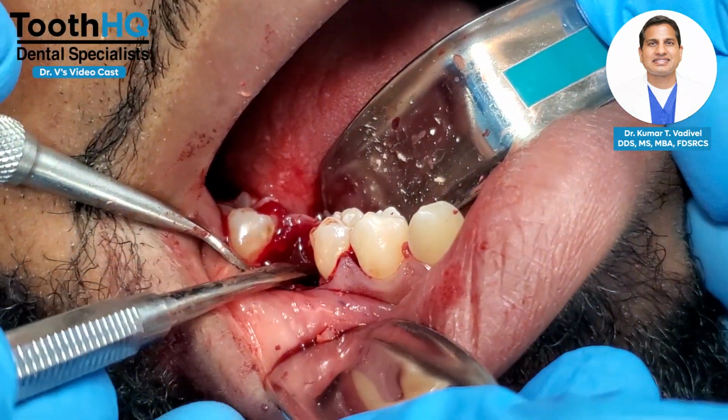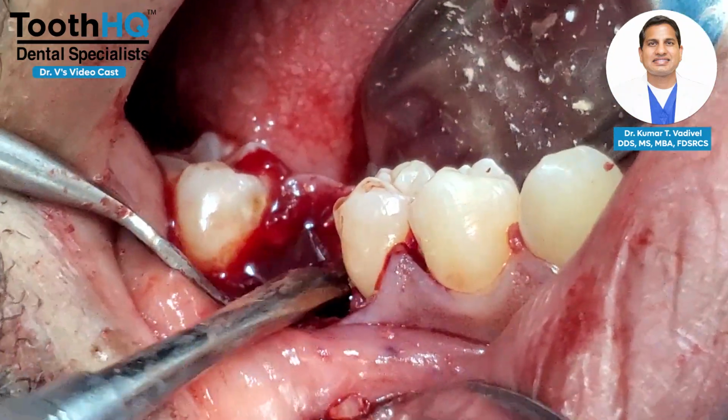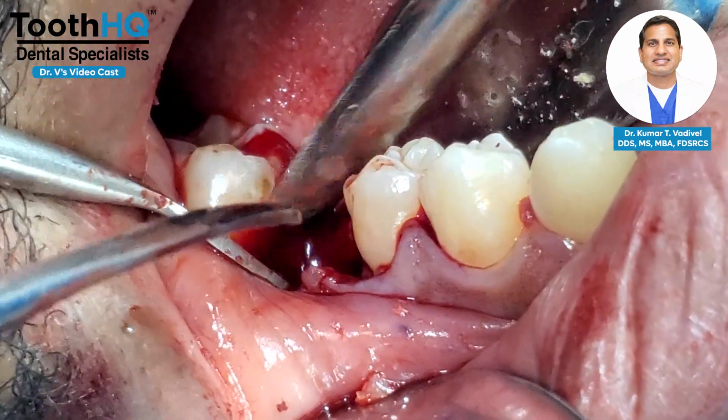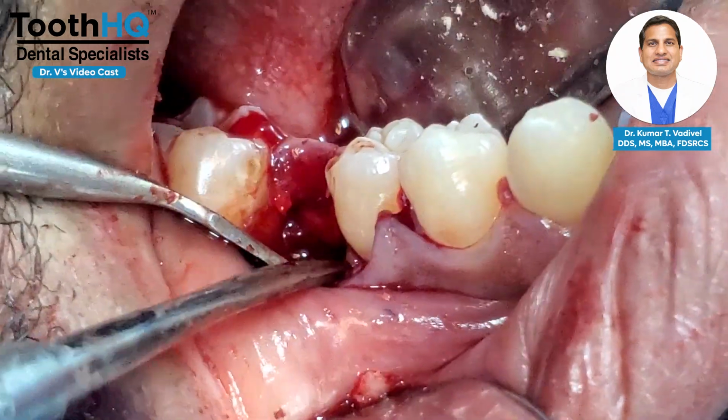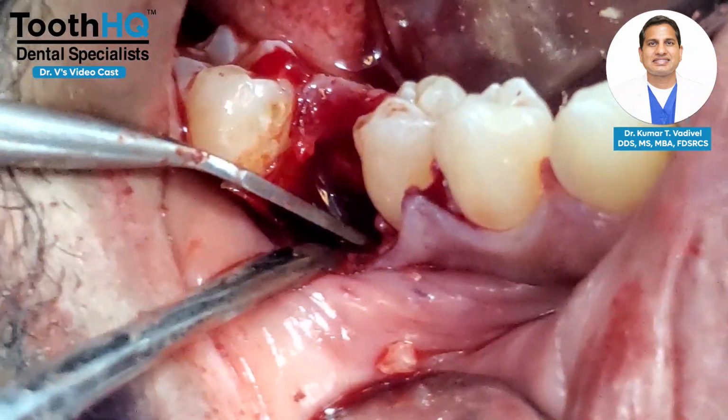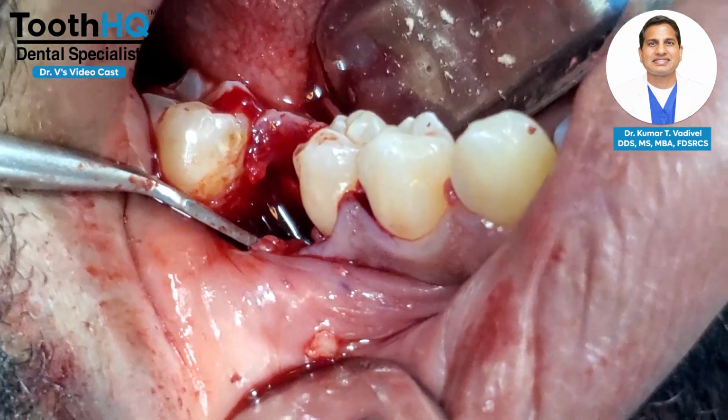See, we didn't take any bone away or anything. The bone is all the way up here. I know it's a little bloody. Yes, okay. So the bone is all the way up here. So now we are ready to do the socket preservation.